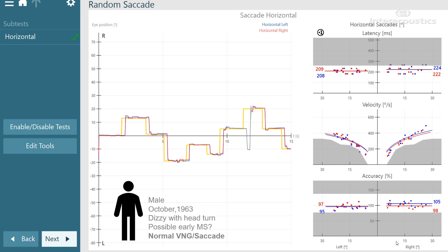Let's bring that together as a case study. Here we have a male born October 1963, presenting with dizziness on head turns. VNG has been normal and has ruled out any peripheral vestibular dysfunction, so we're not looking at any asymmetry between peripheral systems. The suggestion is that this may be an early sign of multiple sclerosis. In the presence of normal VNG and normal saccades, one would think there isn't anything central jumping out. The latency distributions show median values being very symmetric and within the normal range.